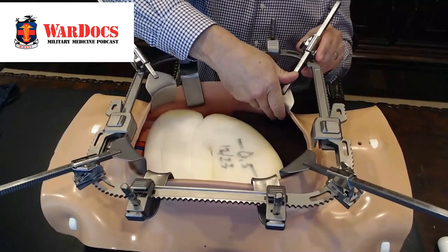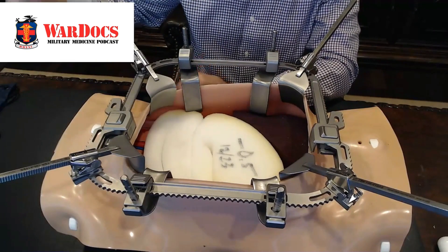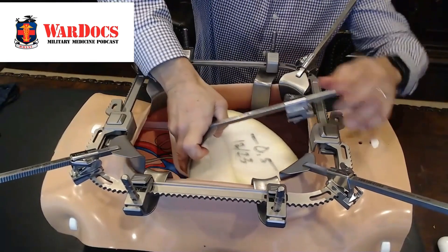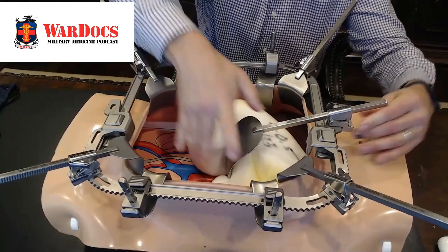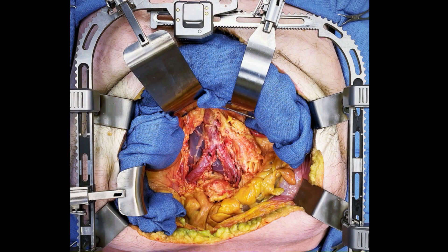I basically start by putting four medium retractor blades on the corners. And as you can see, we've really expanded that incision. We've got four points of contact in the abdominal wall. And then to get to the retroperitoneum, a couple of malleables — imagine that being bowel. This is similar to what I've done in actual cases. You can see the graphic of the aorta and IVC. I've actually done this exact case with this equipment, where I've exposed the left iliac artery using this setup.